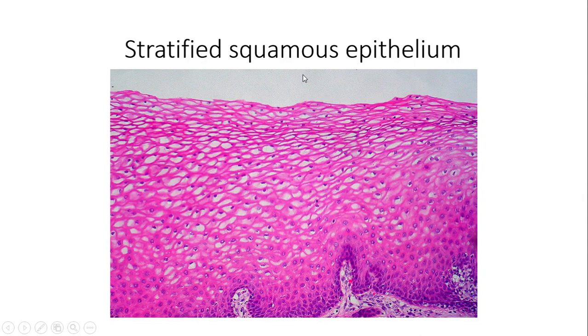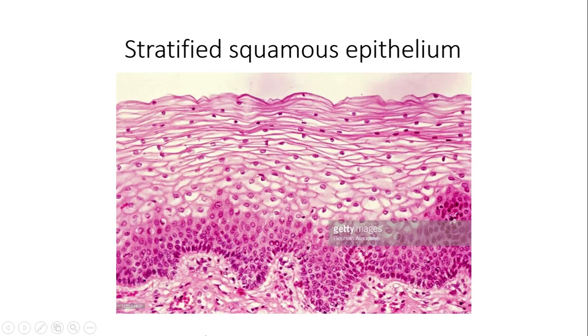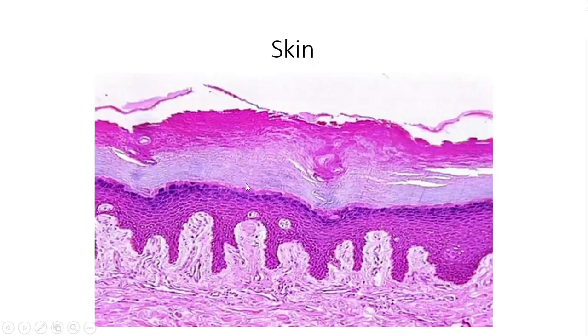They're going to be more zoomed in. This is a more zoomed in picture, and you can see that they're not going to be really incorporating multiple layers all the way to the bottom. Right? You can see the difference between this one, which is stratified squamous, and it's very light here, and it's not too many layers of different colors. And then you look at this one, where these layers are definitely separated between the colors, between the staining dyes and stuff like that.